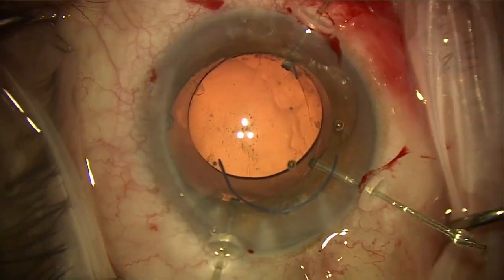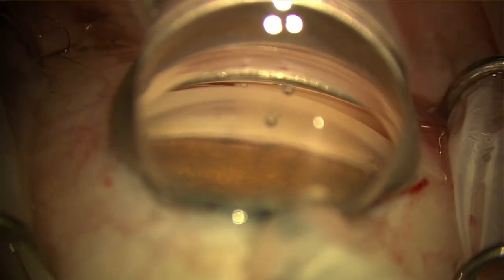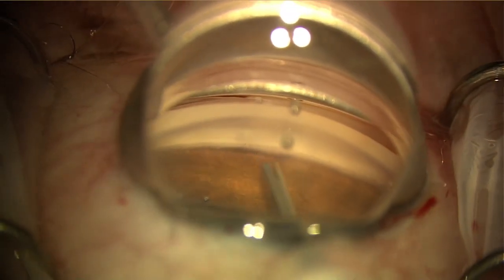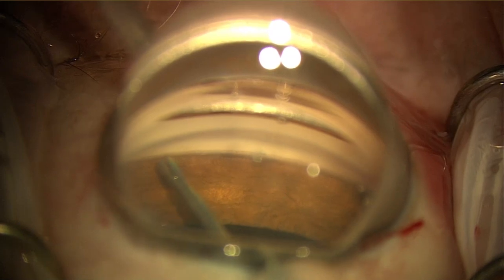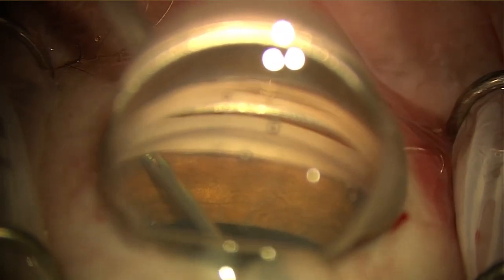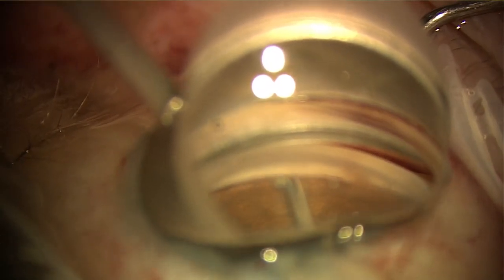We use a 3-piece lens here into the capsular bag, and then we turn our attention to the angle, and we come in again with the iStent infinite delivery system, and we're going to start off by placing the first stent here. And once again the trocar delivery system makes the visualization much easier with this newer system, very similar to the original iStent inject W.